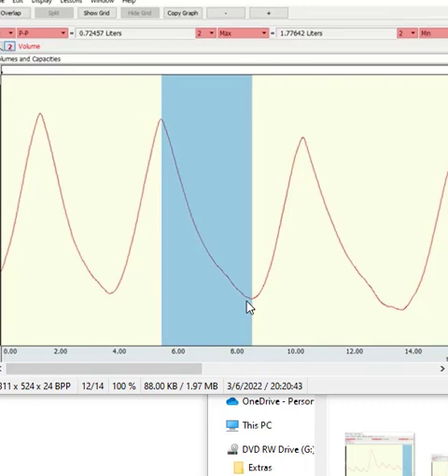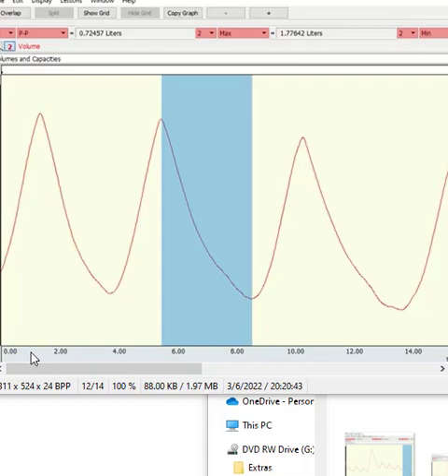Here's a man's tidal volume measurement — from the top to the bottom of the peak — it comes out to about 0.72 liters. Normally it's about 0.5 liters, but being a man they'll have a slightly larger tidal volume. You can also count how many breaths a person takes. The BioPac shows 2-second increments, so at 15 seconds you've had about 3.5 breaths; multiply by 4 to get breaths per minute.